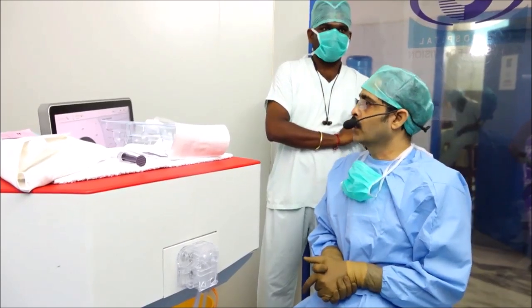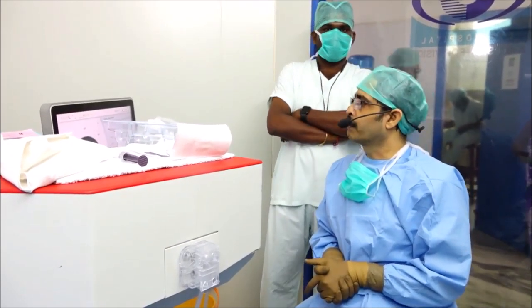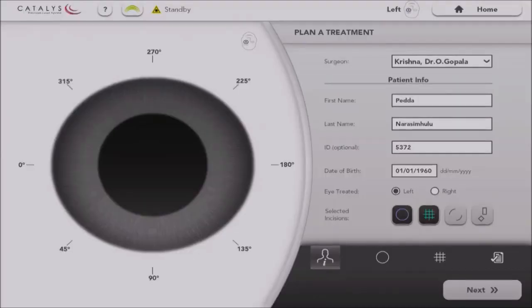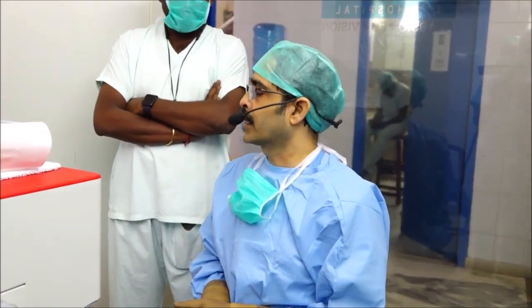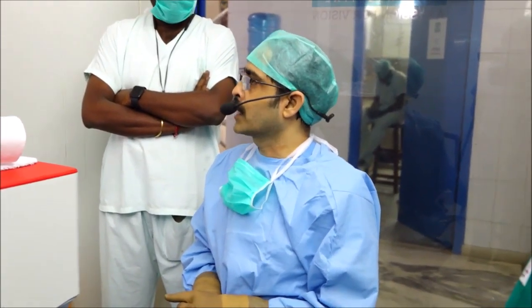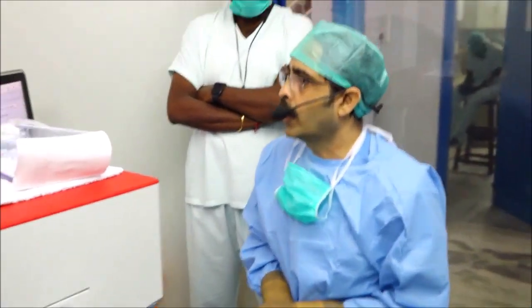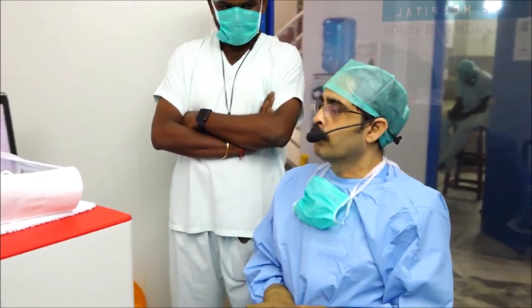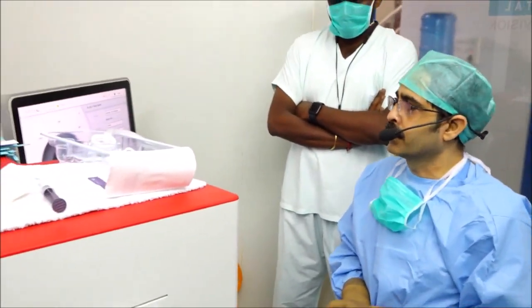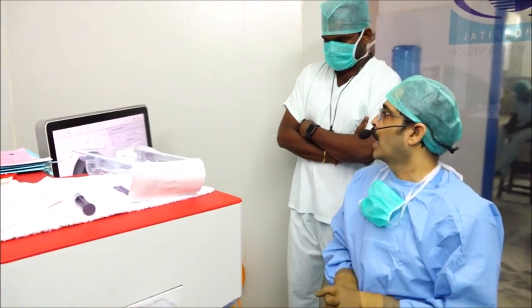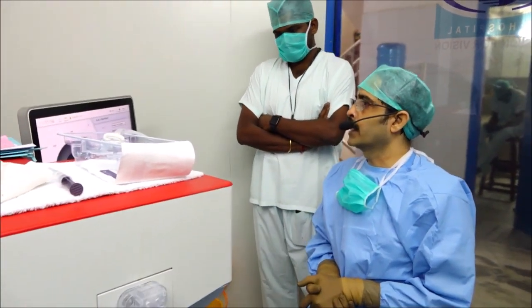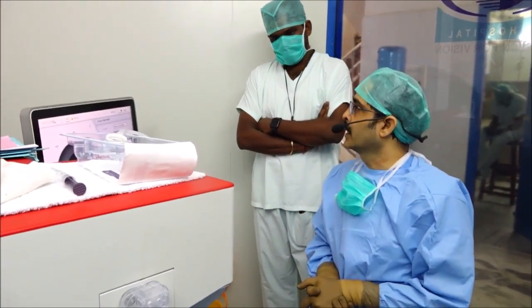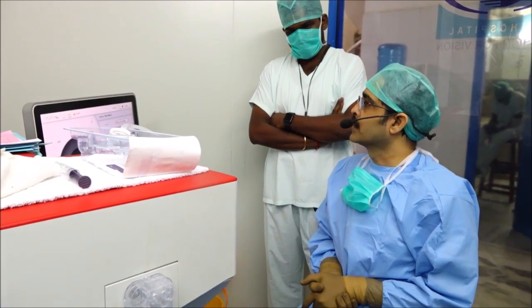I'm going to demonstrate for the first time the live cataract surgery with femto-assisted laser cataract surgery, called FLACS or FLAX or whatever it is. Now I'm in my femto room, which is a little different from the regular operating room, because the femto laser head will not take the formalin fumigation easily.